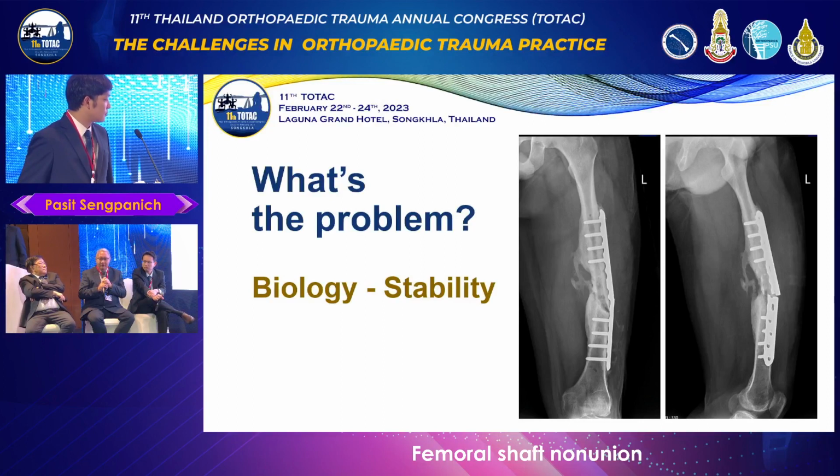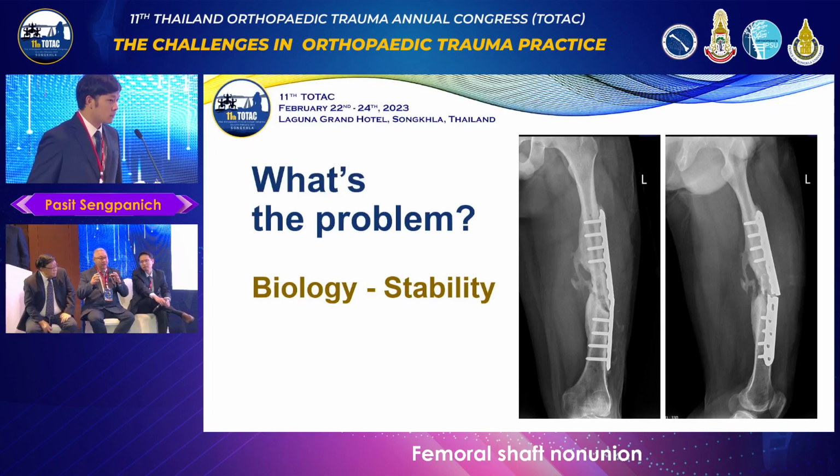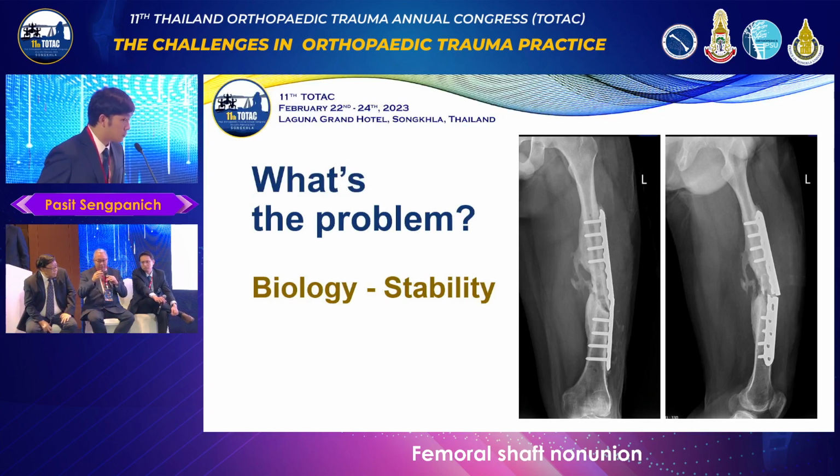it's up to you. If you're confident that there's no infection, if you would have wanted to put an intramedullary device, maybe to make it load sharing, or in our case, probably I would have preferred exchanging it with a circular external fixator rather than just putting another plate in the same area.